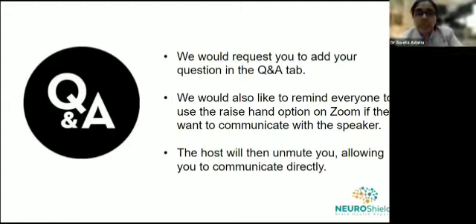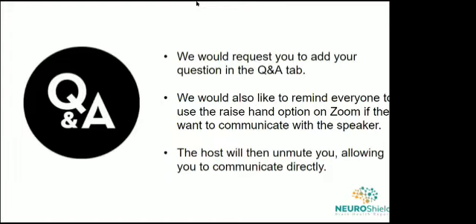Almost always, Dr. Unni. This is our stroke protocol. Every single patient has to have a perfusion, because back where I practice, we have a full stroke unit and everything is set up in terms of radiology. Time for us is a luxury if it's under 4.5 hours, but most of the time the patients come beyond the typical thrombolyzable time window. And that is when the CT angio plus the rapid perfusion plus or minus MRI is of great help. Most of my decisions, even up to 18 hours, 20 hours, we have sent the patients, particularly for basilar or vertebral, for clot retrievals, even beyond the typical traditional time.